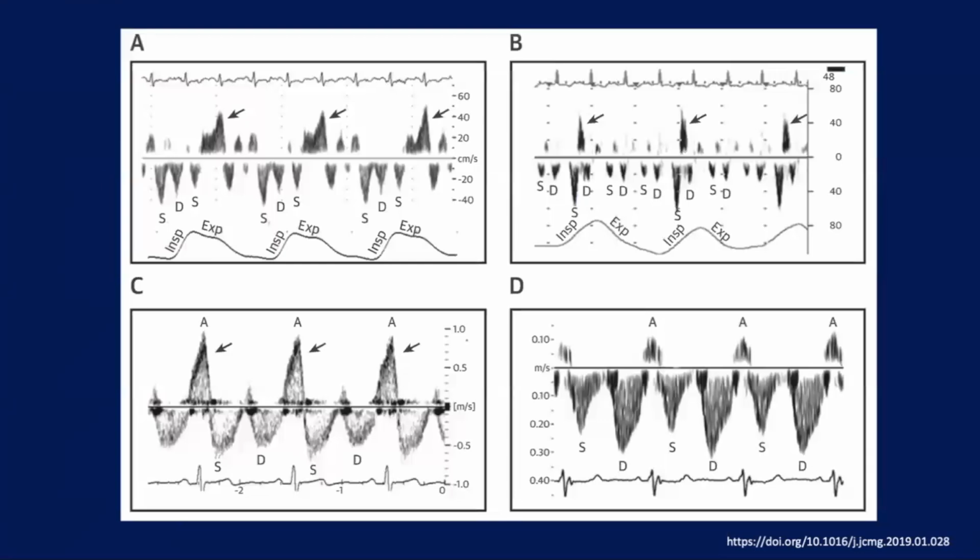And just by recording the hepatic, we can diagnose a lot of diseases. There was a very long list. For example, this one is constrictive pericarditis, restrictive cardiomyopathy, any restriction, pulmonary hypertension, tricuspid stenosis; it will be reflected there.